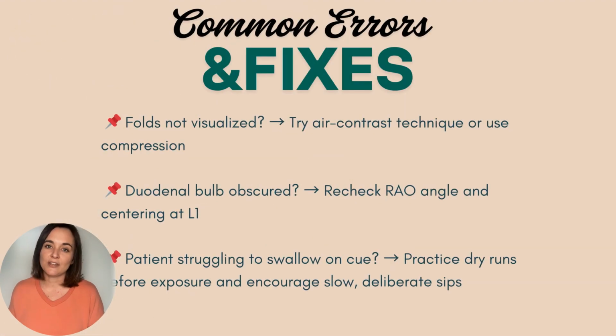Common errors and how to fix them. Folds not visualized. Try air contrast technique or use compression. Duodenal bulb obscured. Recheck your RAO angle and centering at L1. Is the patient struggling to swallow on cue? Practice dry runs before exposure and encourage slow, deliberate sips.